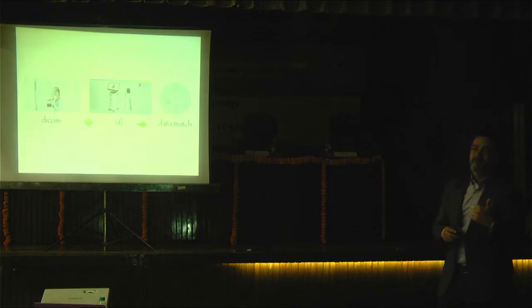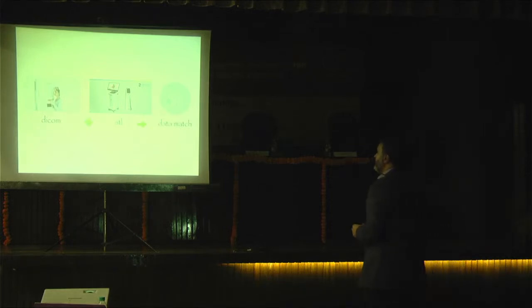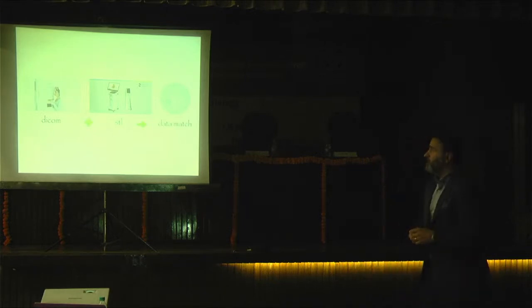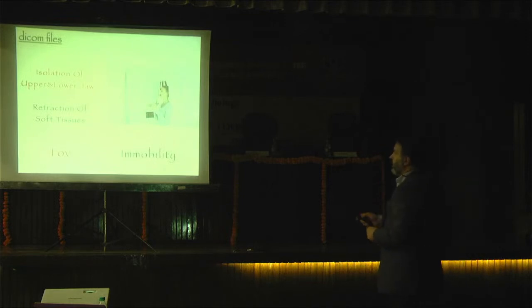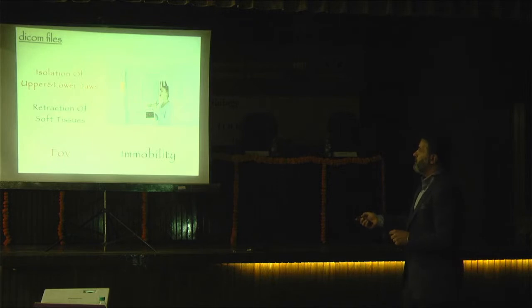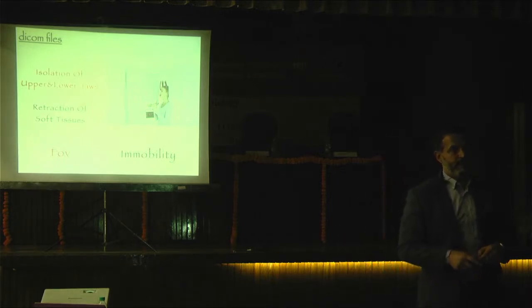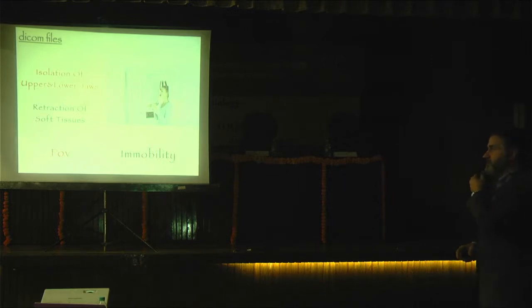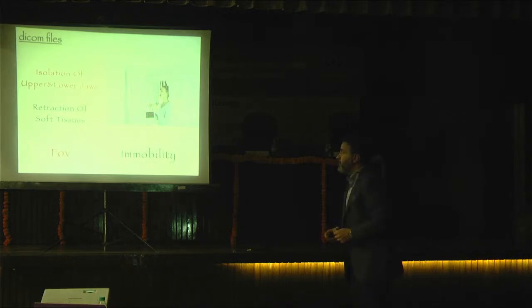And the latest thing is having a 3D printer, which is very easy. And after it, the DICOM data and the STL data are going to match, and we find a design after the data match. I learned that this is the machine that you have in your dental college. This is from Dentsply Sirona Orthophos SL. It's one of the best machines in the world, maybe the best one.